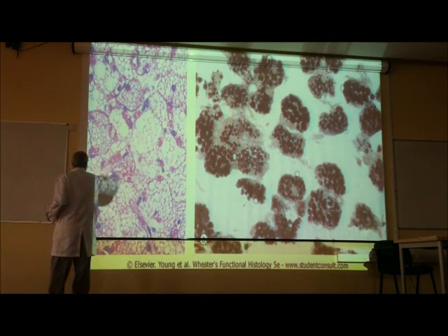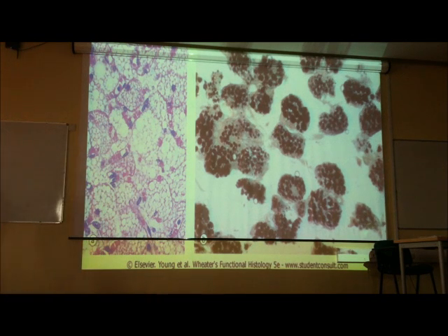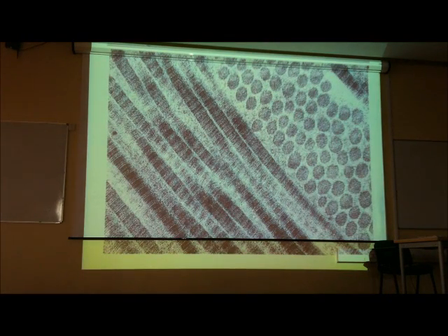It's very nice. Very nice. Look, very cute. Animation coming. I think it's a muscle. Looks like a muscle. Oh, it's definitely a muscle.